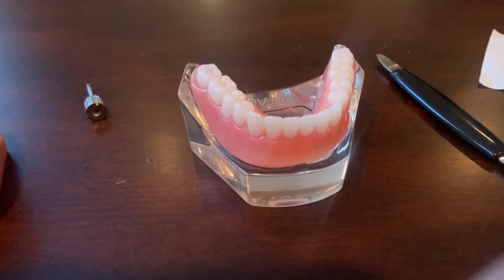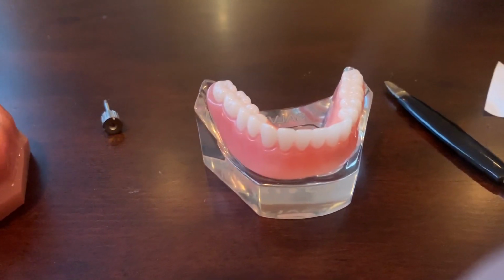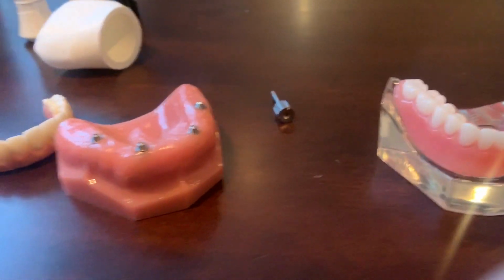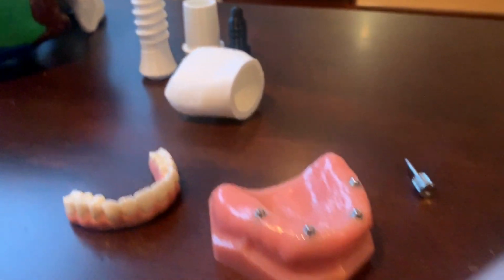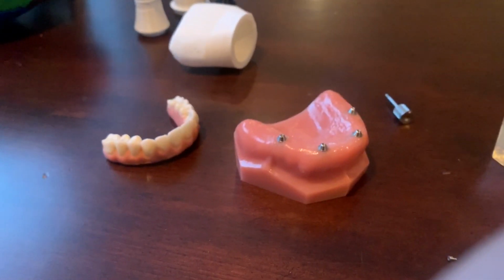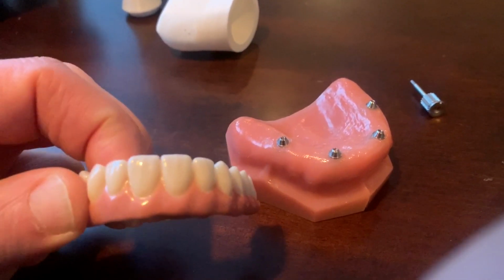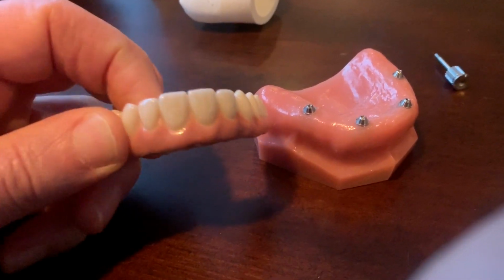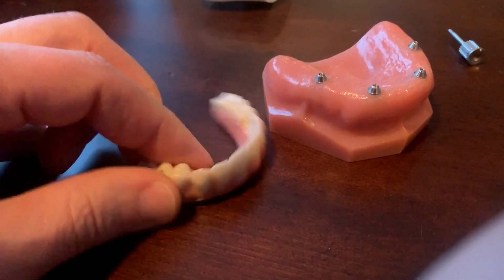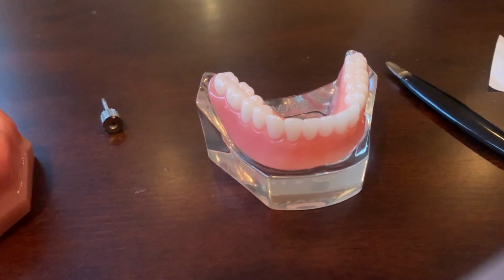And a lot of times cost will be a big driving factor. Sometimes I'll have patients who will go with this removable option, and they'll come back a period of time later, and they will place more implants, and they'll upgrade to a fixed bridge. But anyway, these are the different types of cases, and now you can sort of see how these things work. I will go as far as to say that these models that the lab makes, these teeth really aren't that pretty. Most of the cases that we do, I know this video isn't the greatest, but the porcelain work looks much more lifelike. Even this plastic denture looks a bit better.